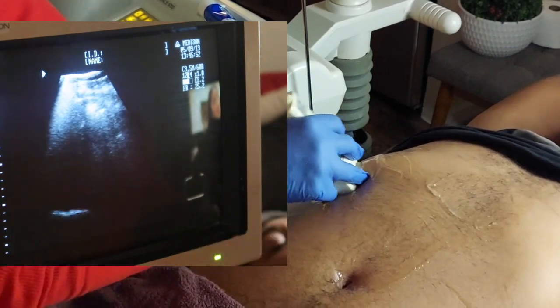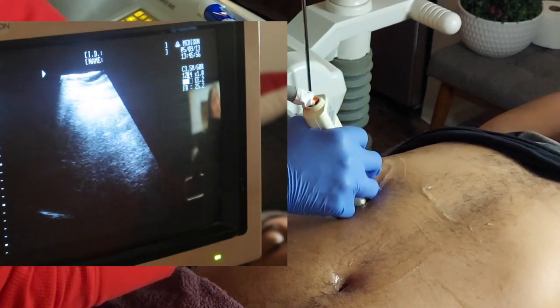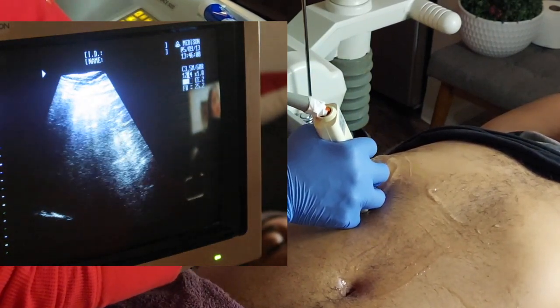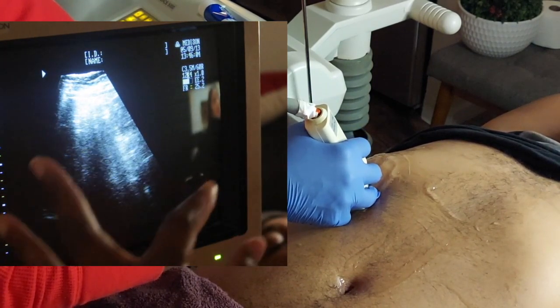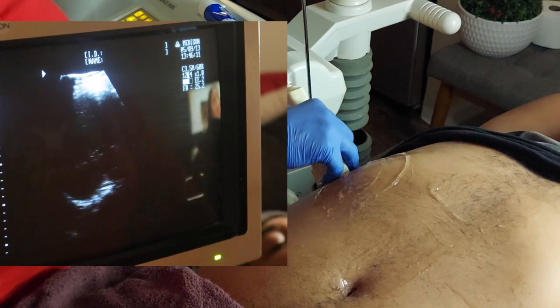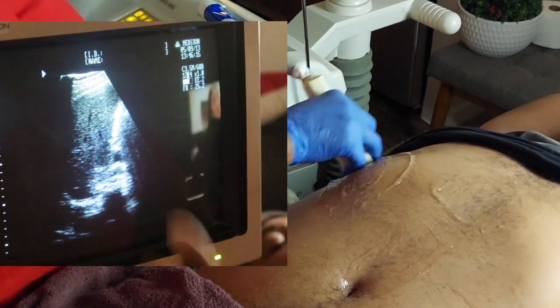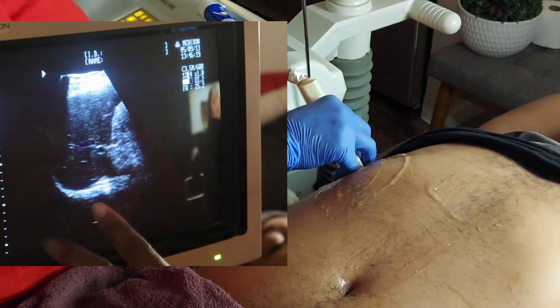Nine times out of ten, the hardest part about scanning a man is they have bigger ribs than women. The plus side is that since they do have big ribs, their intercostal spaces are much larger. Whereas women have smaller intercostal spaces, smaller ribs, and it really blacks out the screen — so we have a lot of shadowing.